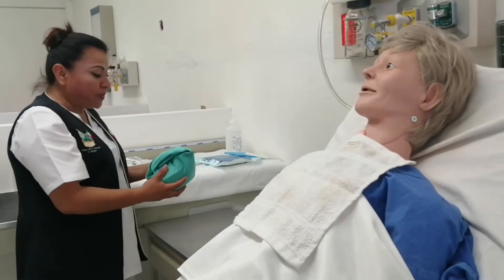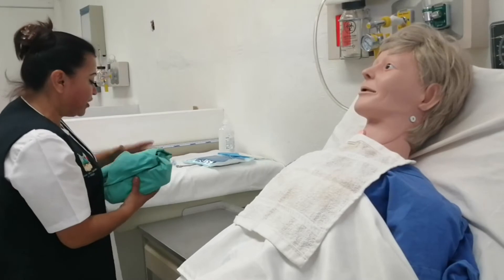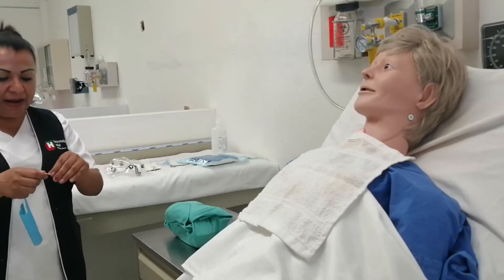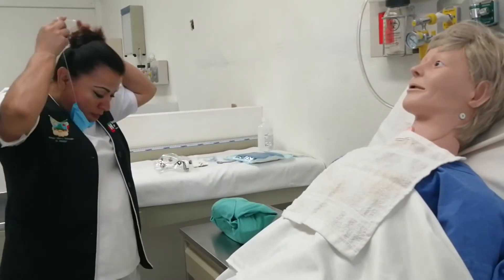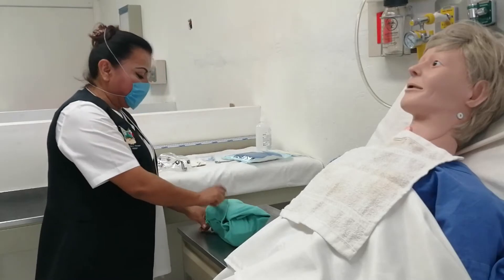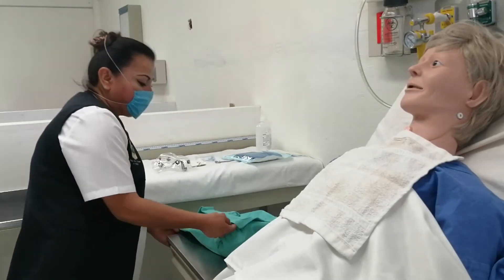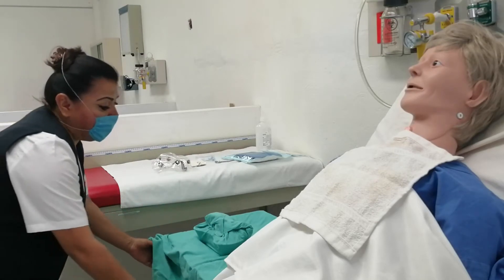El equipo tiene dos envolturas: una doble por fuera y una sencilla por dentro. La primera envoltura la podemos abrir de manera manual. Es muy importante que antes de eso nos pongamos el cubrebocas, porque al hablar podemos botar una gotita y contaminar el campo. Abrimos la primera envoltura respetando los principios de asepsia: primero la punta distal, luego la del lado izquierdo, con la mano derecha la punta enfrente, y jalamos hacia nosotros la última punta.